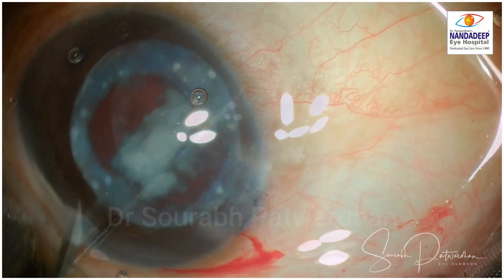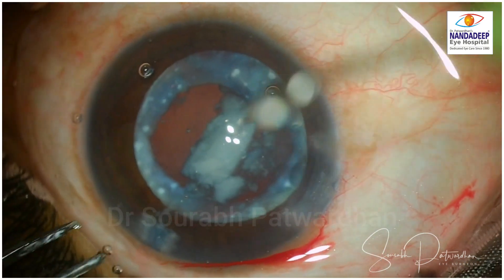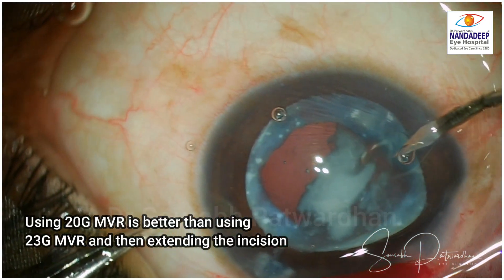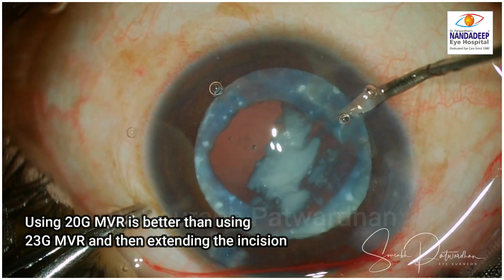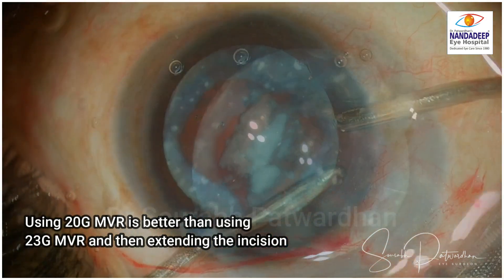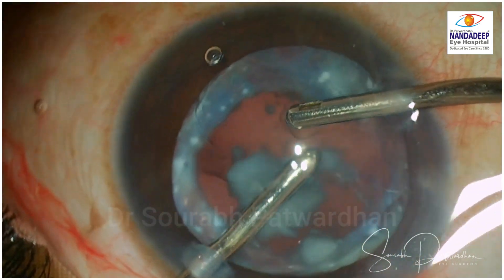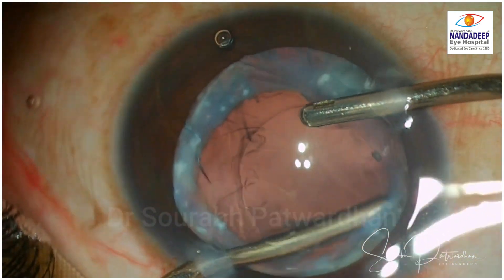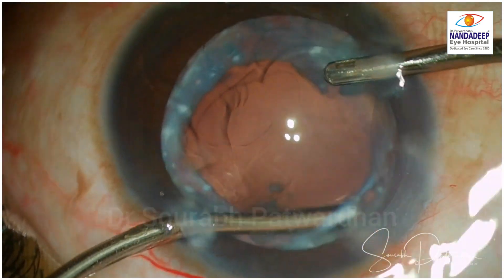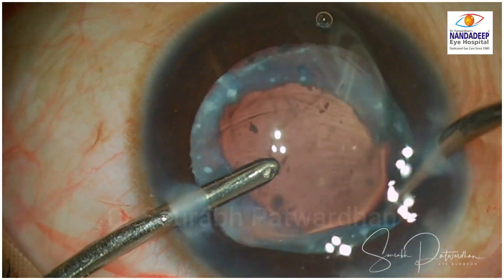There is also corticocapsular adhesion in some areas. As you can see, I teased some out using the Sinski — you can also use an iris repositor. Now here I made a mistake: I used a 23-gauge MVR and then tried to enlarge it to 20-gauge using the same instrument. There is always a risk of creating ragged edges, as I did here. The incision was not good and I had to suture it later. If you are using 20-gauge bi-manual irrigation-aspiration, you should use a 20-gauge MVR so there is no leaky or ragged incision.